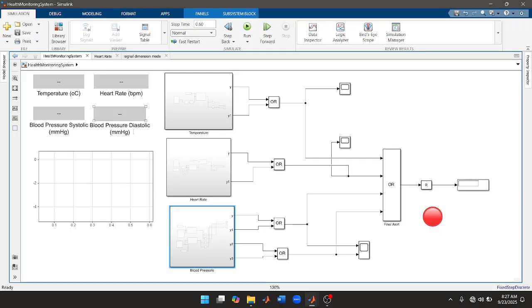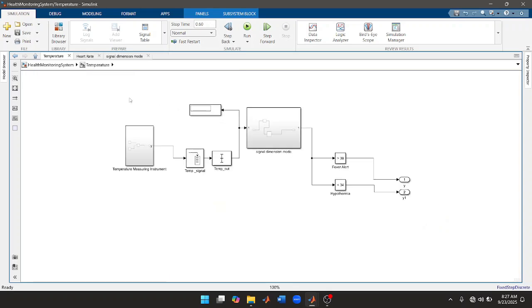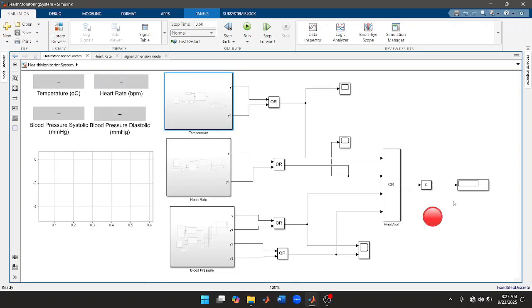Then the health professional can also read the vitals here. Why this is there is to ensure that both the health professional and the relative of the patient can monitor the health of that patient. It is just a simple system. So this temperature, if it goes above normal, you get your red alert. If any of them goes above normal or below normal, you have a red alert.